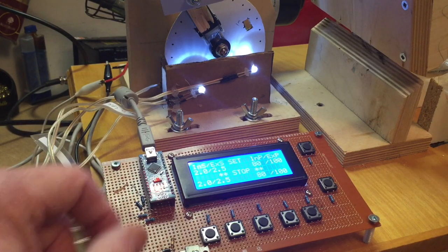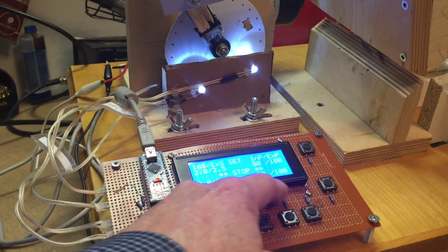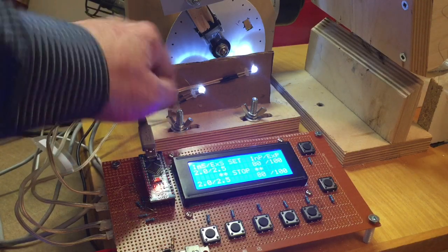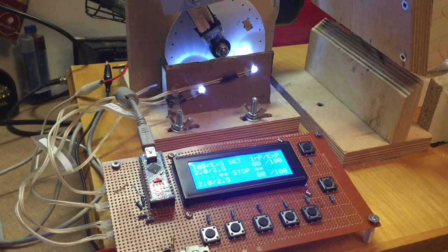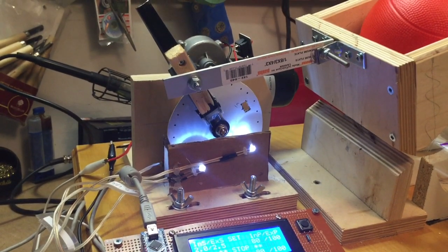As well as being able to adjust the inhale and exhale durations and the inhale and exhale power, you can also adjust the stroke of the machine. You can slide the motor assembly back and forth to either increase or decrease the amount of compression on the bag. This means it could be modified for pediatric and adolescent size ventilators.